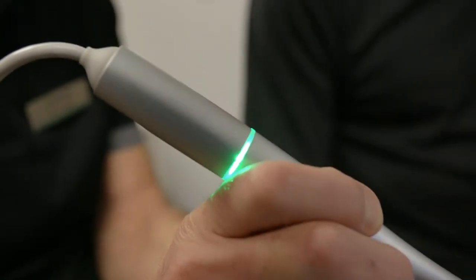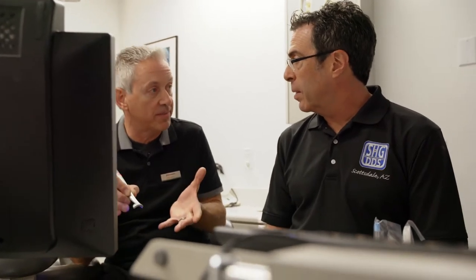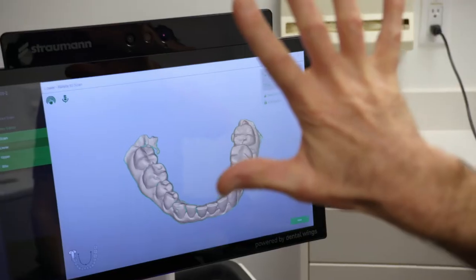You have this green ring, and you can hear it scanning. You don't have to look away from the patient — you're focusing on the patient. And you know that it's working. That is wonderful.